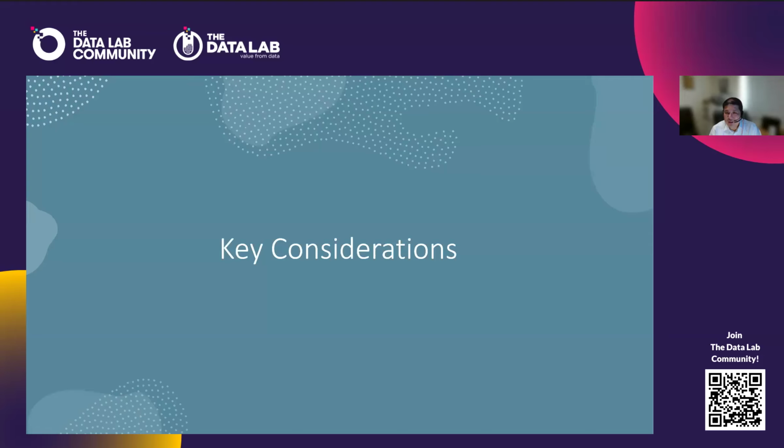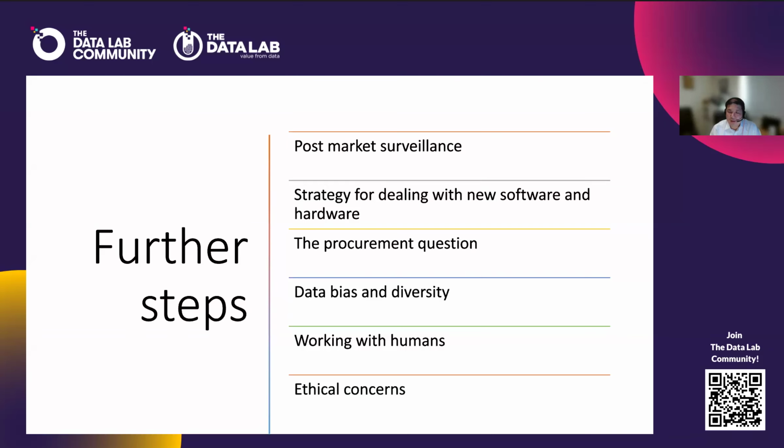But there are some key considerations and caveats, and there are reasons why we're not using it fully and widely in the NHS at the moment. There needs to be post-market surveillance coming in. If AI changes, and I'll talk about this afterwards, we need a strategy for dealing with that. Certain AIs are only trained on certain software or certain hardware or different machines. So if you change all your machines to a different manufacturer, will that AI still work on those machines?